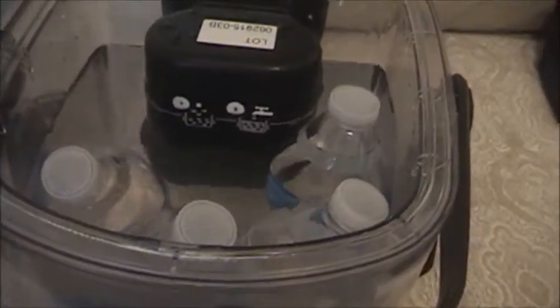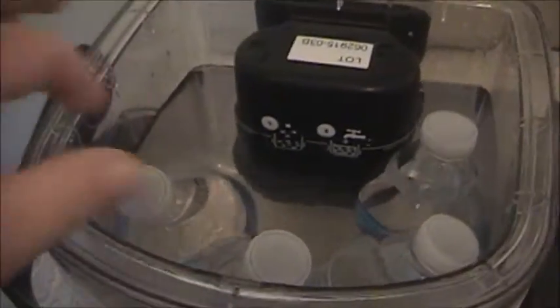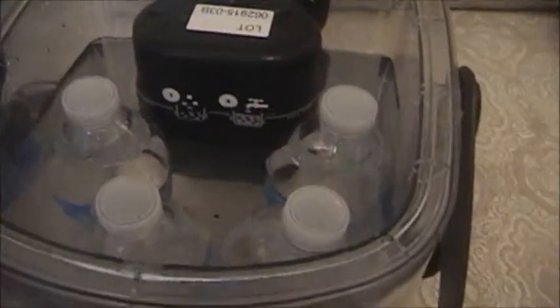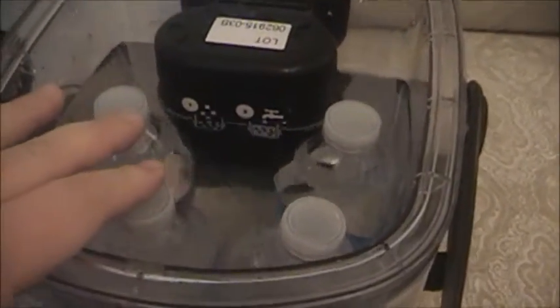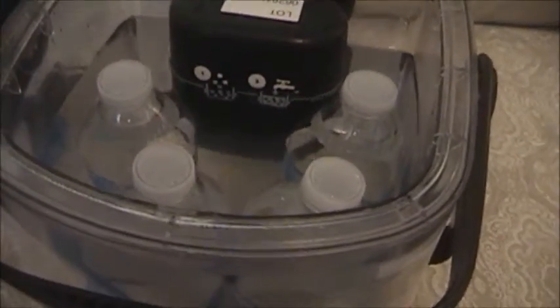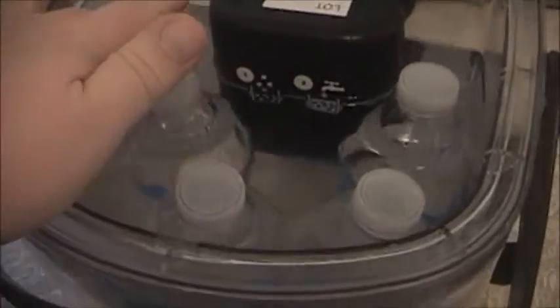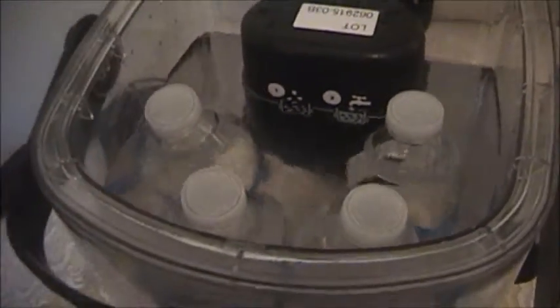But my dad figured out a better way, and the therapist actually confirmed this. What we do is we take these water bottles, this one just happens to be from Harris Teeter, and we put 4 of them in there. These are totally frozen at the time. We keep these in the freezer. We have up to 10 of them in the freezer. And that keeps the water at the perfect temperature for this.